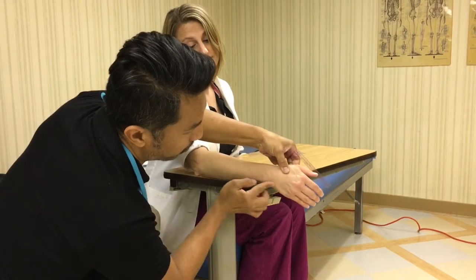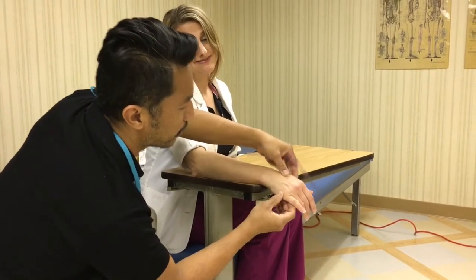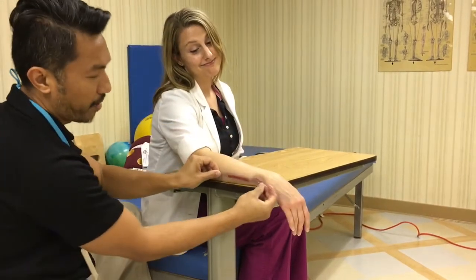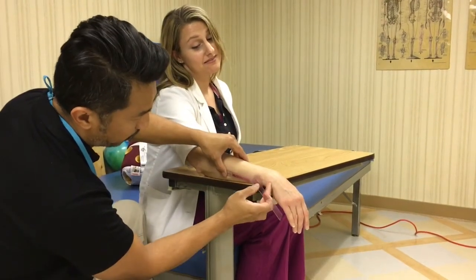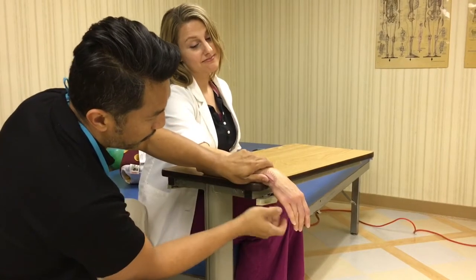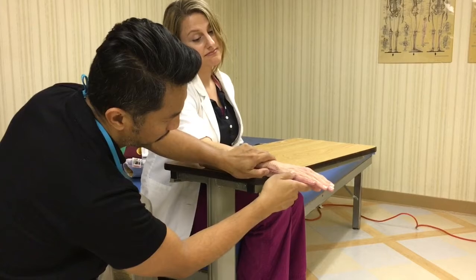This is our fifth metacarpal right here by the pinky. Okay, so non-moving arm on the shaft of the ulna, axis on the triquetrum, and the moving arm on the fifth metacarpal.